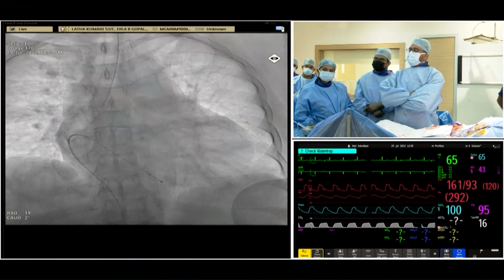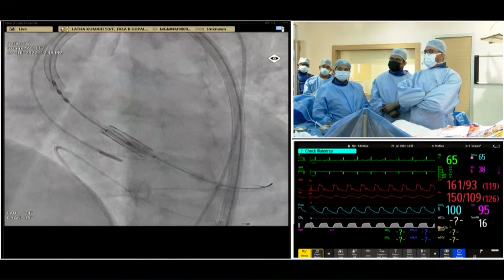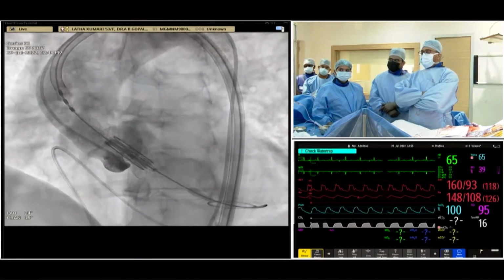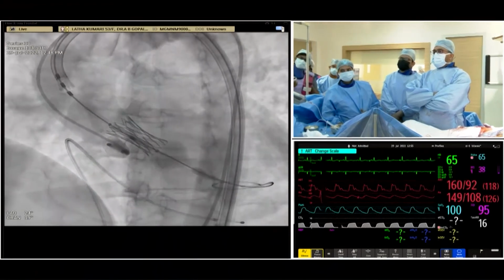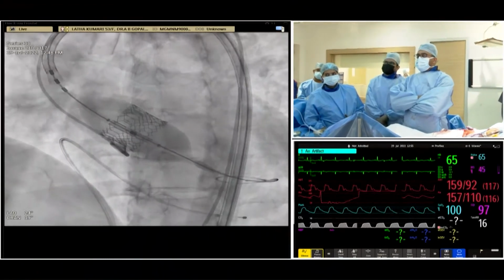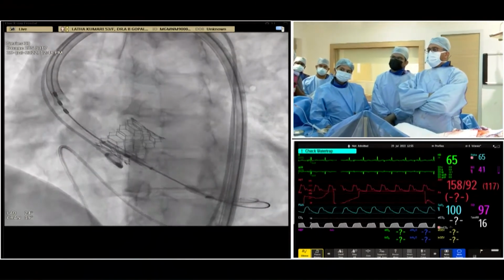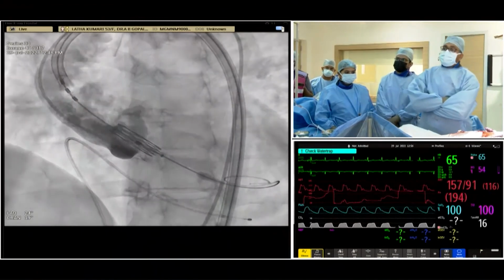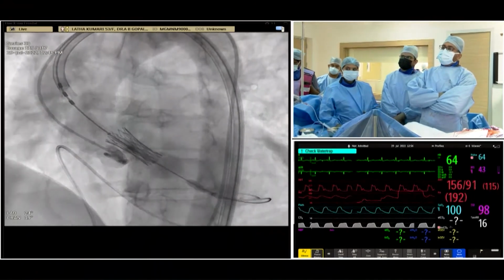As we were going up, you can see here, as we were positioning it, the valve and the balloon, there was an offset of 1.5 millimeters. I think you all agree on that. So my positioning was based on the translucent area. And the plan was during implantation, if there was any concern, I'd pull it back a bit. You can see my tension there on the delivery system. The idea was slightly to pull back and push on the wire, so that we get as high an implant as possible, because the membranous septum was only 3.5. I was really worried this patient might end up with a pacemaker, hence the reason for that.